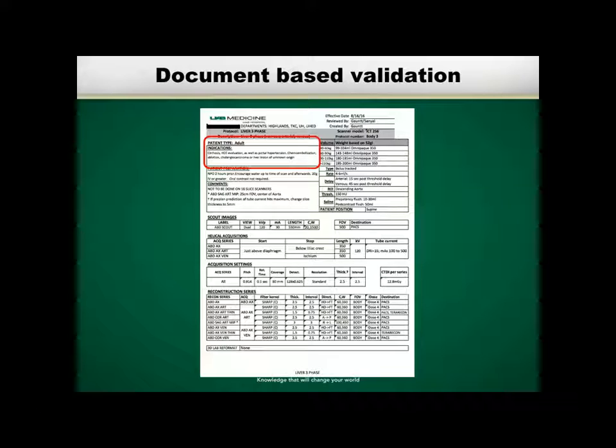For example, indications. What patient problems would cause someone to require this exam protocol? Is this an adult or a pediatric protocol? We've got injected contrast information here. We've got all the information you would need to describe the acquisitions, including how many different acquisition series there are, and some kind of label for those acquisition series.